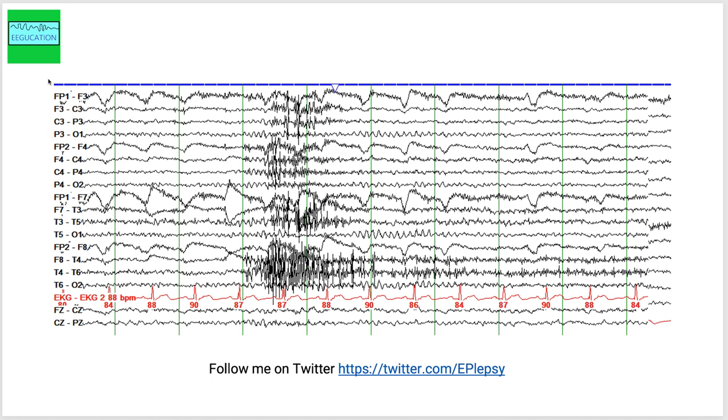The electrodes are placed in a certain distribution that we call a 10-20 system. I'm not going to—I have had a previous tutorial on 10-20 system and you can review that. So the channels here, the channels that end with an odd number are recording from the left side of the brain.